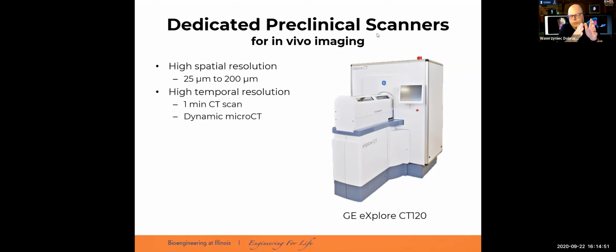If you try to acquire very quick scans, which will not take too much of your disk space, you have to accept a poorer resolution. So 200 microns was the poorest resolution for this particular system. All the systems have these two extremes: one is the best resolution that you can get, and the second is the lowest resolution, which allows you to save time and also space on the disk.